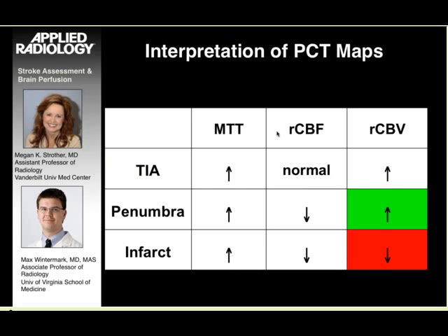So in summary, two big groups of perfusion CT technique: whole brain and dynamic. Dynamic can have limited coverage or also be whole brain. Then you have different types of algorithm, different types of software, but two big groups, basically a maximal slope model and central volume principle, and different types of map that can have different names. So again, you just need to know what your software does and what types of map it produces and how they are called by your particular manufacturer.